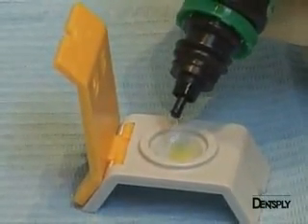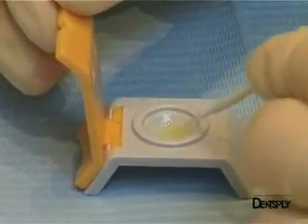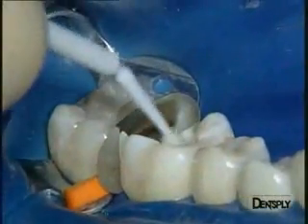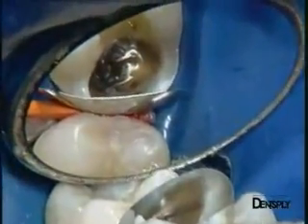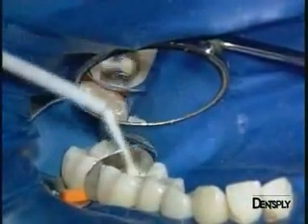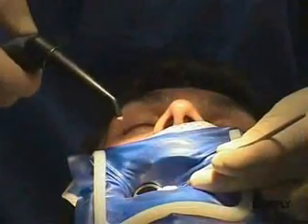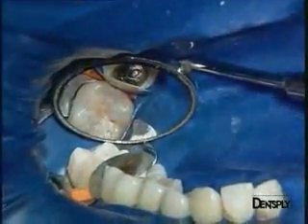We are looking at a two-bottle system. One drop from each bottle is placed inside the small mixing device — this Dappen dish — which allows a good homogenous mix, provides effective protection against evaporation of the solvent, and protection from the operating light between two applications. The Xeno3 adhesive system is applied to the dentine, taking care to ensure that it penetrates all areas of dentine to ensure satisfactory seal and adhesion of the restoration. Do not forget to evaporate the solvent carefully so as not to lift the adhesive away, and we light cure with the SmartLight PS.